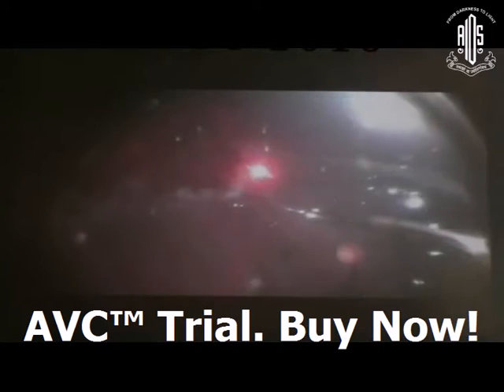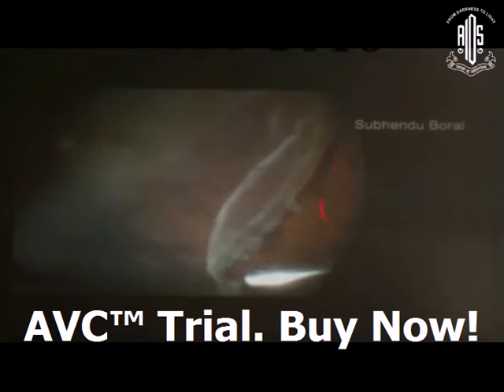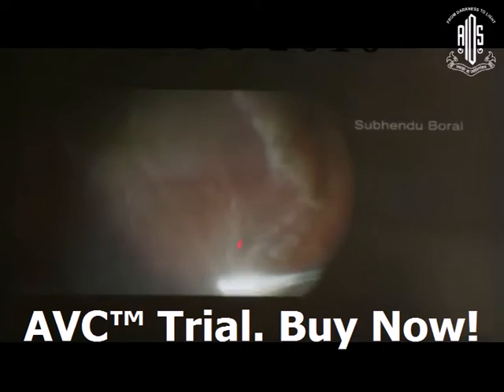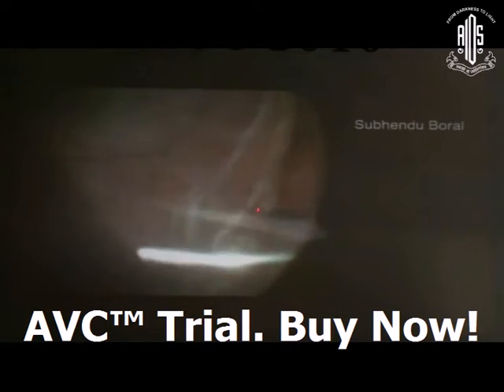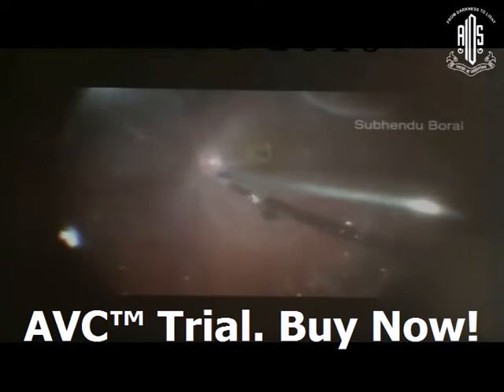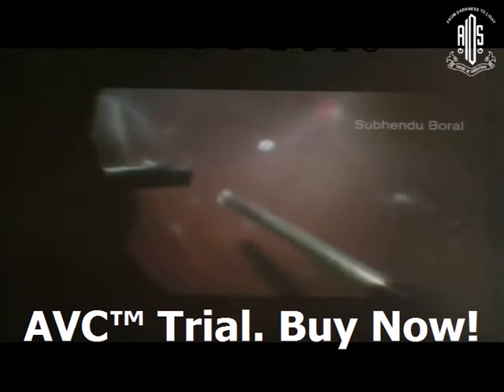Now coming to the situation with giant retinal tear with frank detachment — subtotal detachment. There was a GRT with more than temporal half detachment. Do good vitrectomy, trim the margin of the giant retinal tear, and in this kind of situation with frank detachment, you must always inject PFCL and drain the peripheral subretinal fluid through the peripheral breaks.